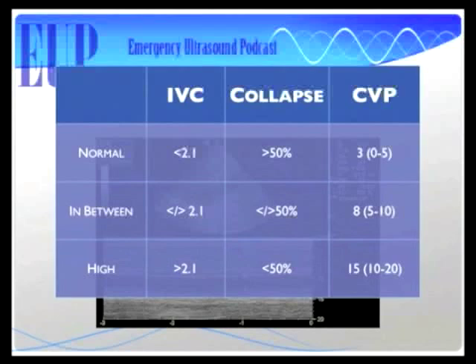So what does this mean if I didn't know what the letters CVP stood for? If I had no idea what that means, can I still use this, someone as unintelligent as myself?